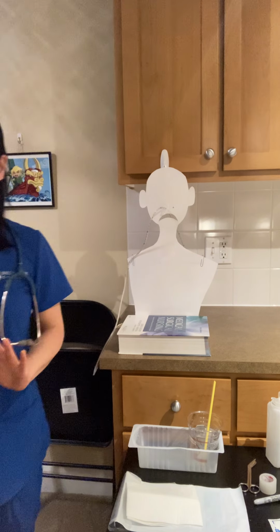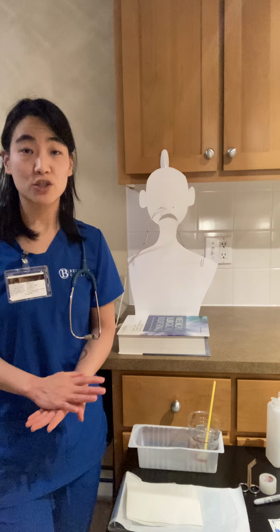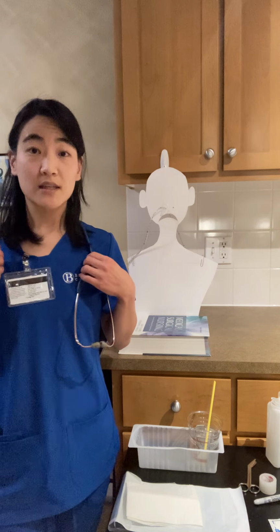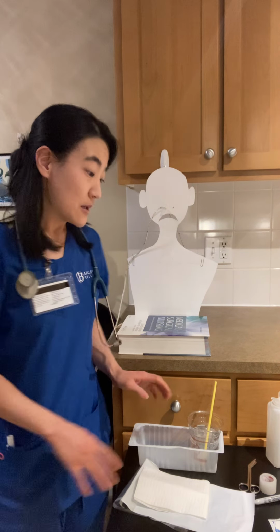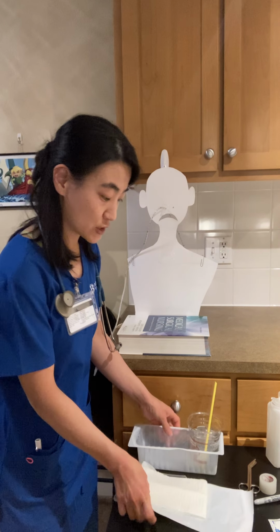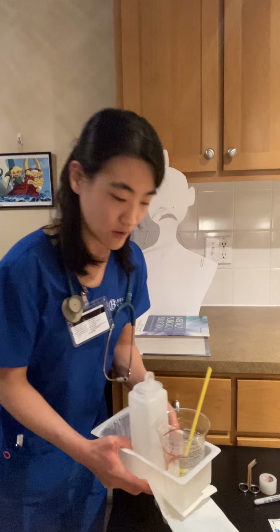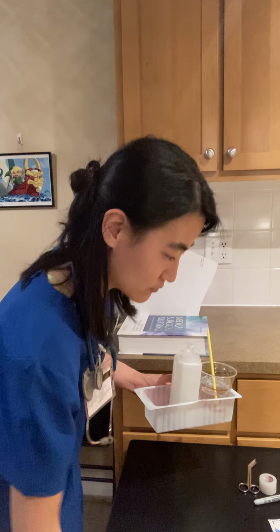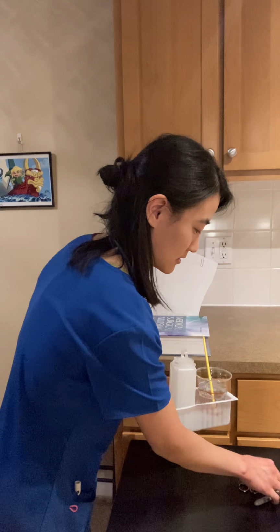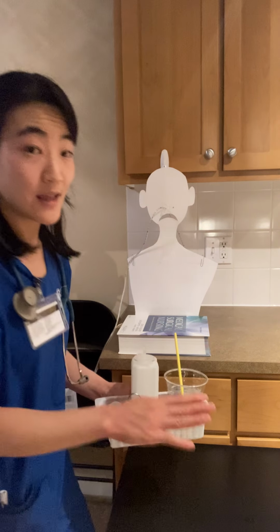And then as I leave, I will close the door to provide privacy, and then I will document the procedure in the MAR. Actually, not yet. Before I leave, I would make sure to clean up and dispose of all the equipment and garbage in the proper receptacles. Alright, and then I would leave and give privacy.